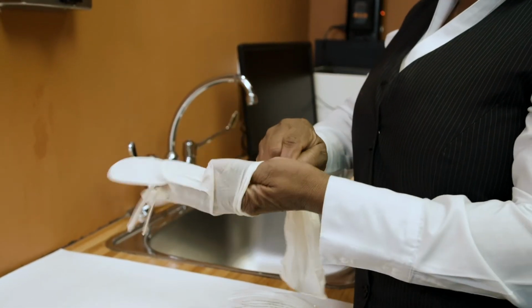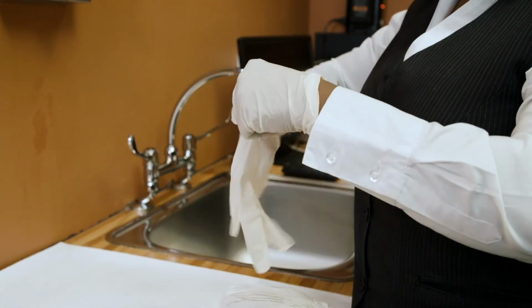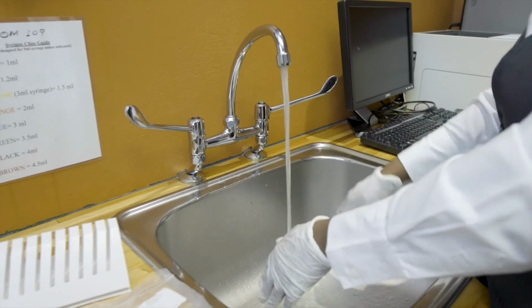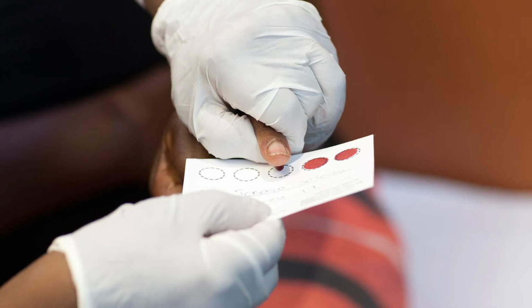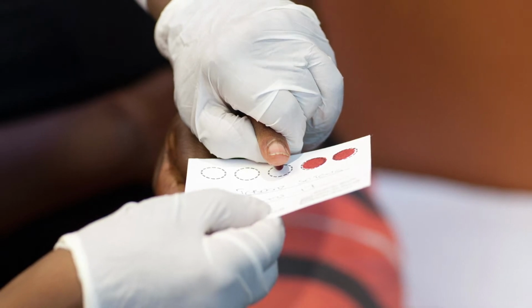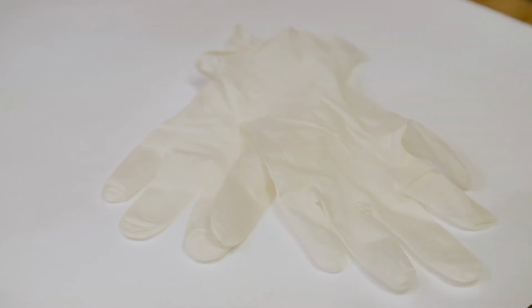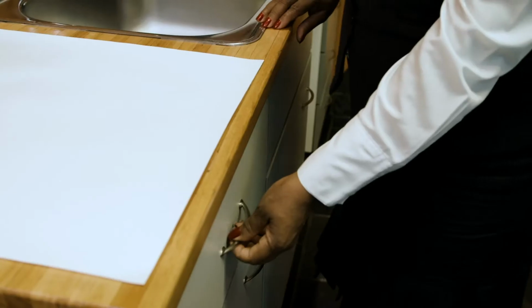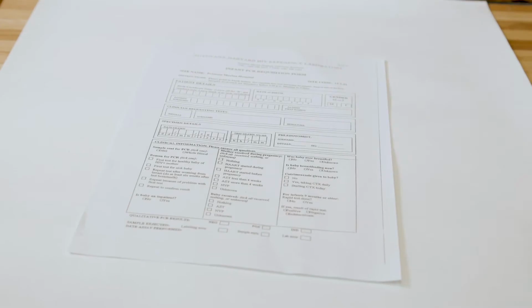Gloves with no powder are best because powder can interfere with PCR testing. If your gloves have powder, you must wash it off the gloves before handling the DBS card or touching the patient's finger to the DBS card. It's important to have a new, clean pair of gloves for each patient that receives a test. Finally, gather your necessary lab forms, a DBS collection card, and a pen.